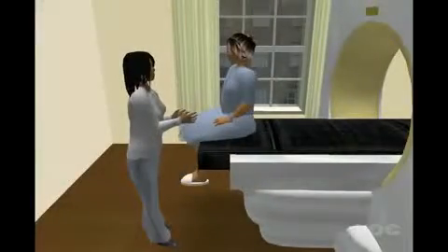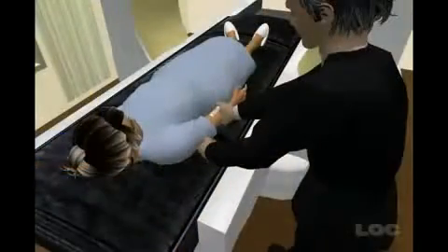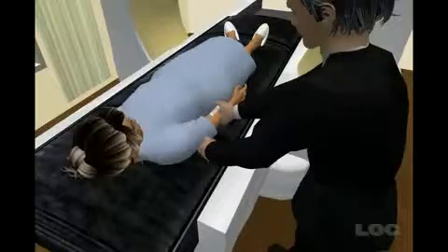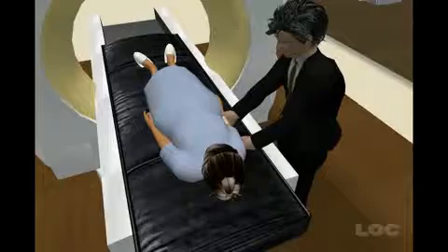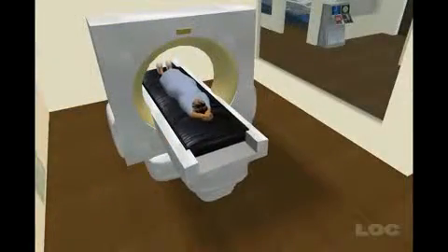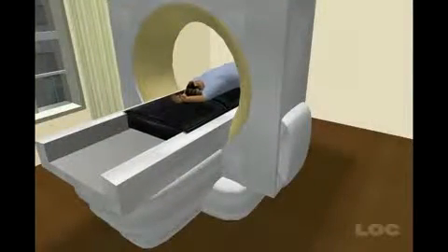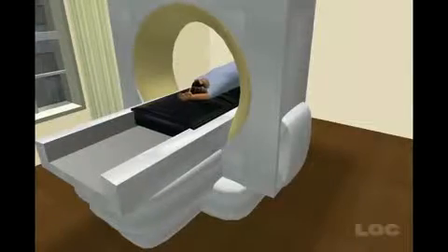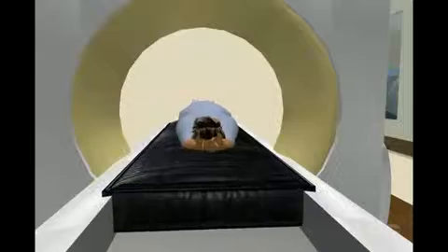You'll be helped onto the scanner couch by the radiographer. These days, most people go into the scanner feet first. Before the scan starts, a small needle will usually be inserted into your arm for the injection of a contrast medium. This is a liquid that enhances the definition of the scan. You'll go through the scanner twice. The first time is to get a general picture of the whole body, and the second is to obtain the detailed scan. The actual scanning only lasts about 20 seconds, during which time you'll be asked to hold your breath.